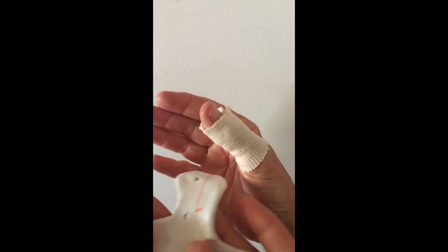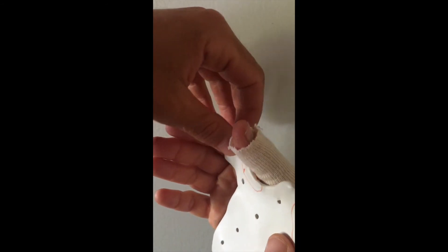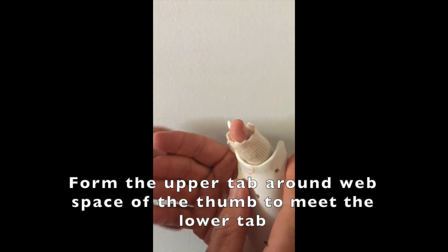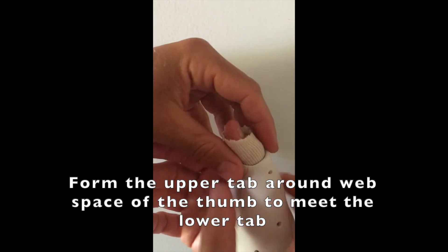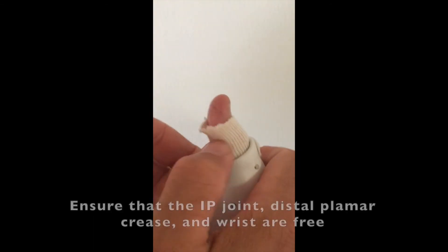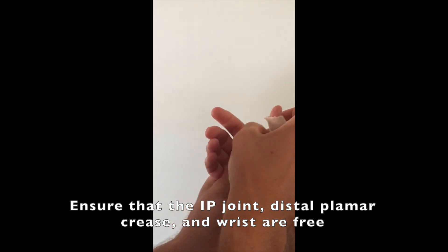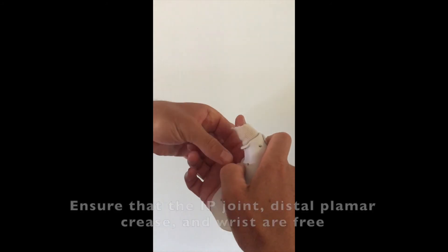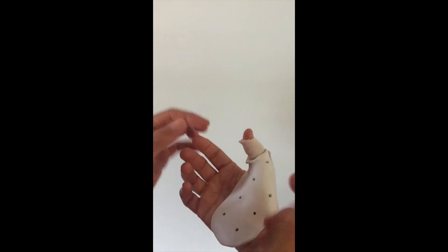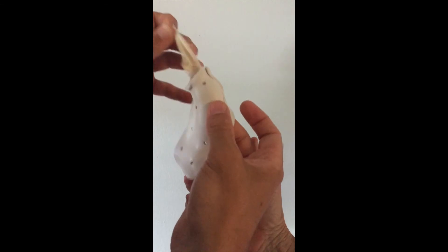Here we have the splint pattern. What we do is bring this tab on the inside of the web space like this, wrap it around, and it's going to attach right over here. Then take it all off together, being very gentle, taking it off at the same time — and it comes right out.